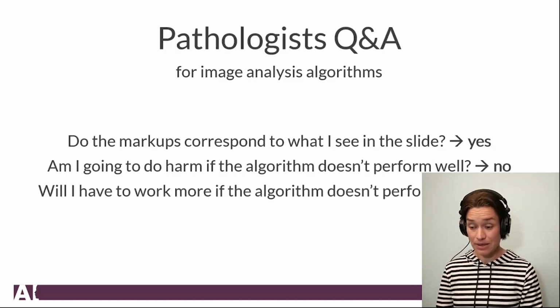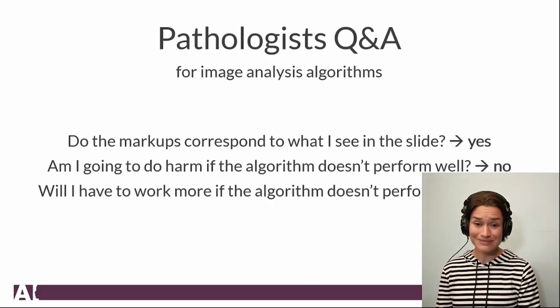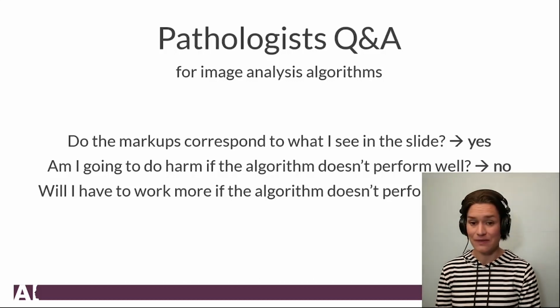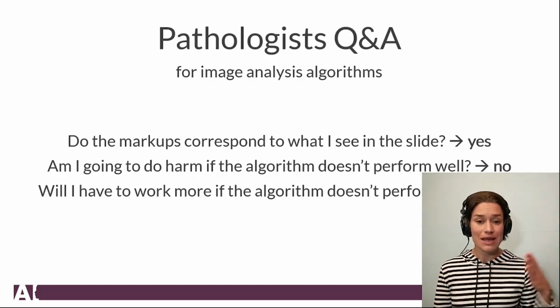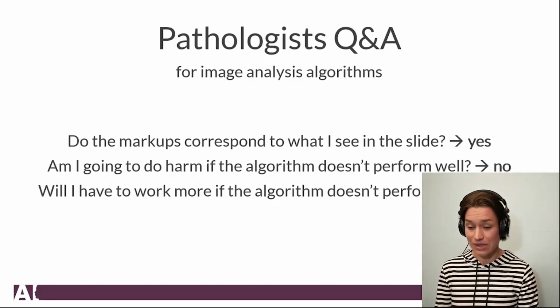Another thing is whether I have to work more if the algorithm doesn't perform well. Let's say the screening algorithm would not perform well. In general, from a life and death perspective, that's not a big deal because you send more people for an additional test to rule out or rule in.